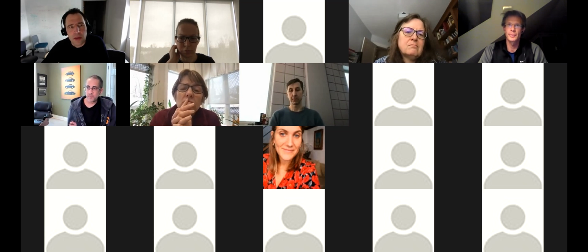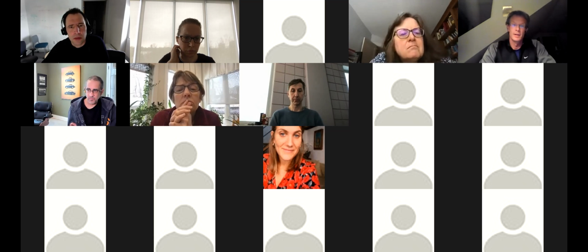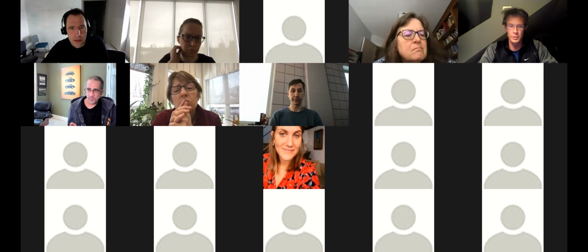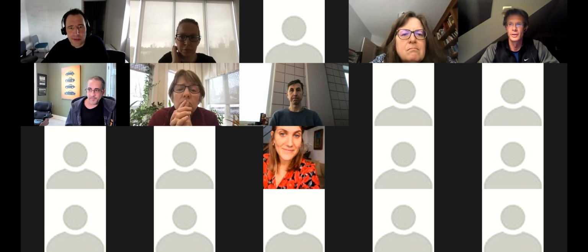Yeah. It honestly surprised me what she found. I would have thought you'd be better off with a thin slice and a decent in-plane resolution and single echo, and then just do proper physiological noise correction and all the blah, blah, blah, instead of compromising resolution so much and then going for multi-echo. Because mind you, if you compromise spatial resolution, your voxel volume goes up with a power of 3, right? If you go from say 1.5 millimeter isotropic to 2.5, I don't know what factor that is, but it's a pretty crazy factor, and the physiological noise goes up a lot.